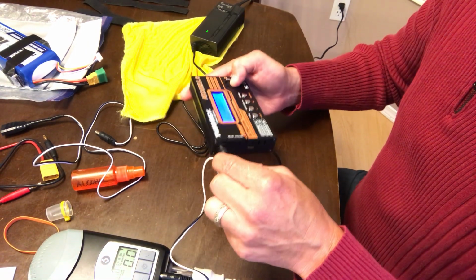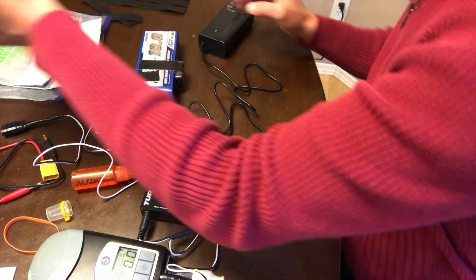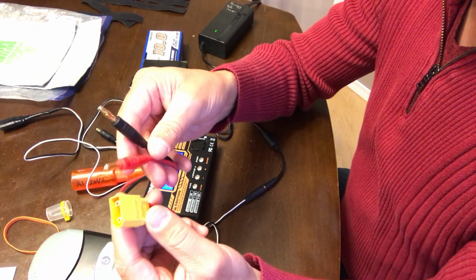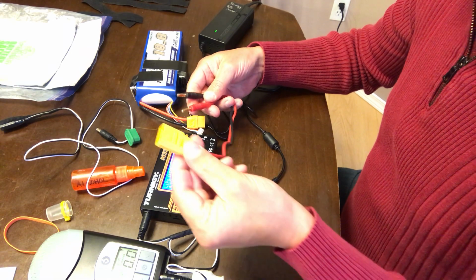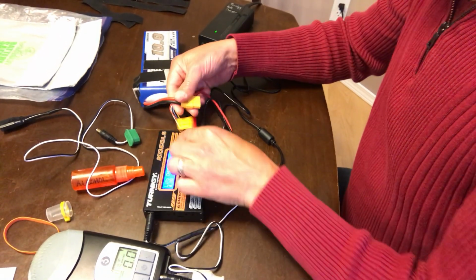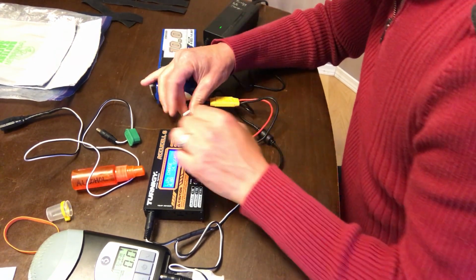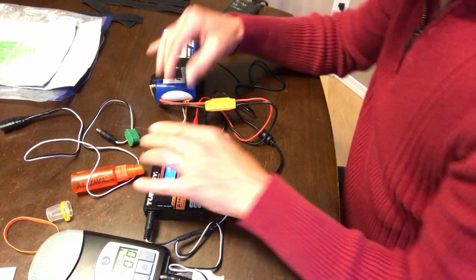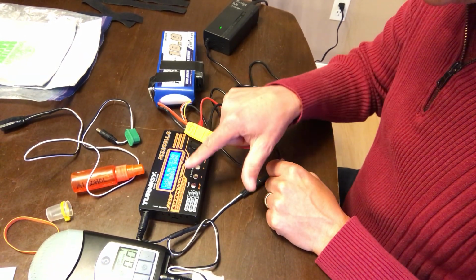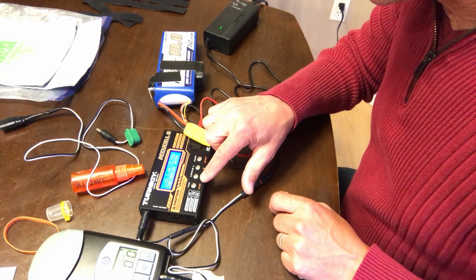So I can plug this in, and then with my battery, so I have a couple of these chargers. These came with the charger, I think, and then I had to buy the XT90 connector that fits the battery. So we plug those in, we plug the battery in, and then we take the extra battery wires and plug those into the charger as well. And then I've got it all set up already. You'd have to do your own setup, but it checks the battery, you hit start, and then it starts charging. And it can tell you the voltage of each of the cells, and then it does more.